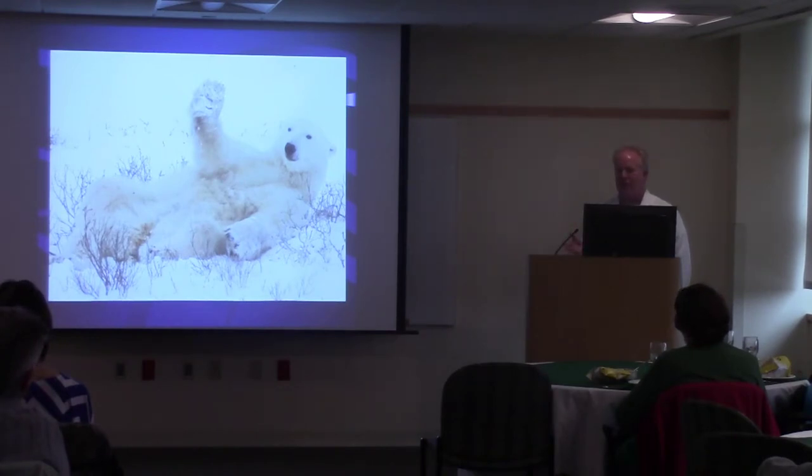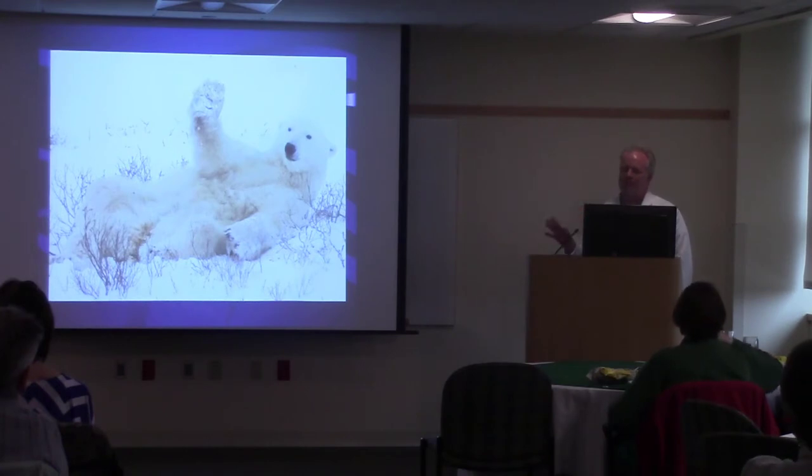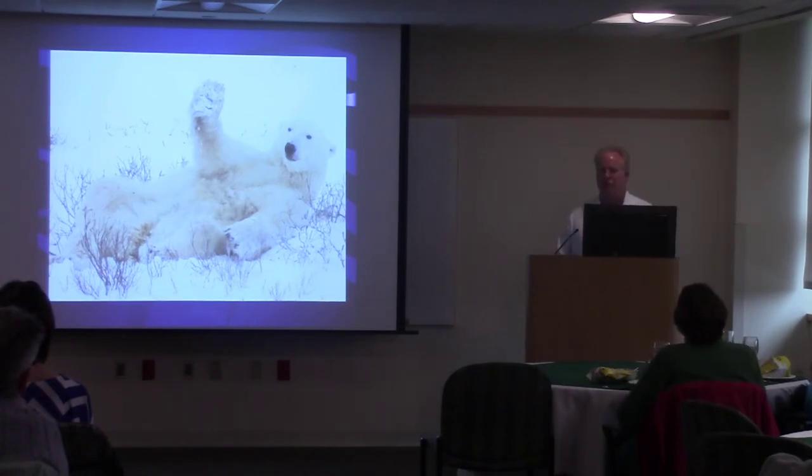They're actually doing some other trials with patients who have cardiogenic shock. So they have a big heart attack, and they come in and their heart is not working well at all. They can't even supply enough blood pressure to perfuse their bodies. And so we put the pump in to support that. And those are patients who usually have the pump in for longer. They might have the pump in for a few days. So there's a big registry looking at patients with cardiogenic shock all across the country. And we're tracking outcomes using the pump in those patients. They have other research studies ongoing for treating heart attacks using the pump to assist patients who are having heart attacks or may not be in shock. There are some trials ongoing with that as well.